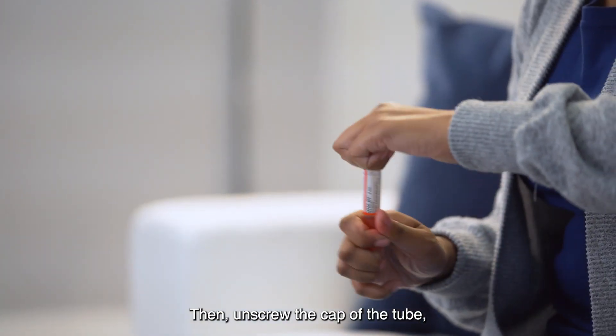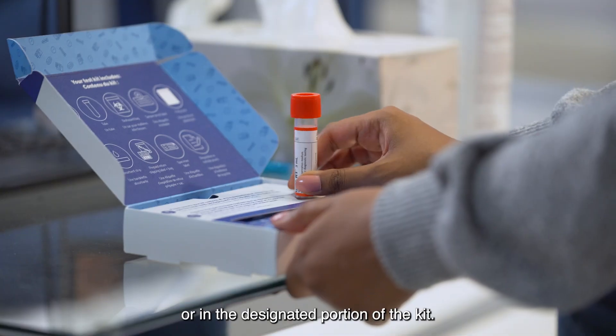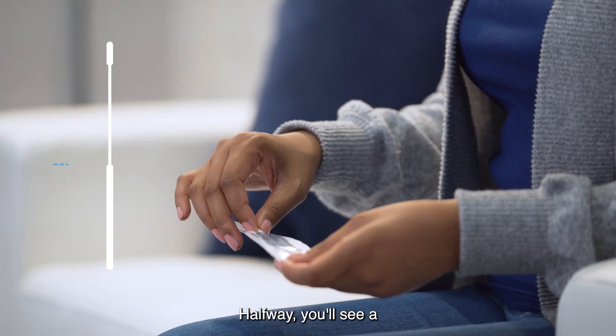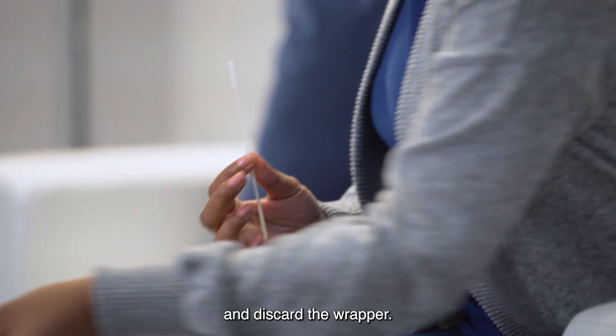Attach the label to the tube being careful not to cover the barcode. Then unscrew the cap of the tube, placing it right side up and placing the tube on a flat surface or in the designated portion of the kit. Then unwrap the swab slowly by pulling the wrapping at the non-bristled end. Halfway, you'll see a faint line on the swab — pinch it to remove the swab and discard the wrapper.